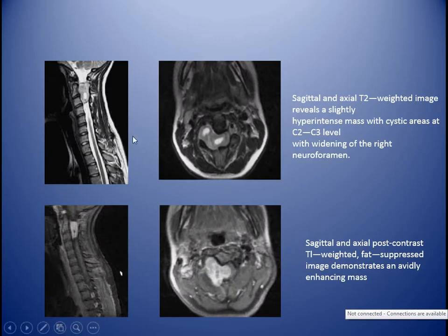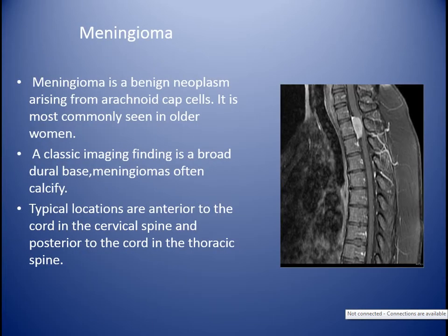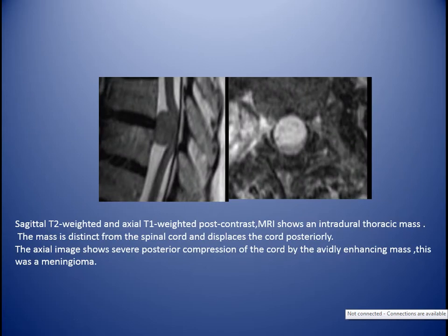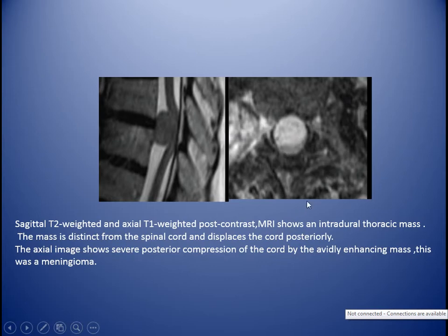Sagittal and axial T2 MRI reveals a hyperintense mass at the level of C2-C3, causing widening of the neural foramina. Post-contrast T1 fat-suppressed image demonstrates an avidly enhancing mass. Meningioma is a benign neoplasm arising from arachnoid cap cells, most commonly seen in older women. The classic imaging finding is broad dural-based meningioma, often calcified. Typical locations are anterior to the cord in the cervical spine and posterior to the cord in the thoracic spine. The T2 and axial T1 post-contrast images show an intradural extramedullary mass displacing the cord posteriorly with marked enhancement.